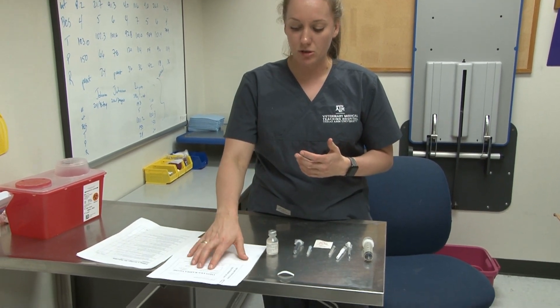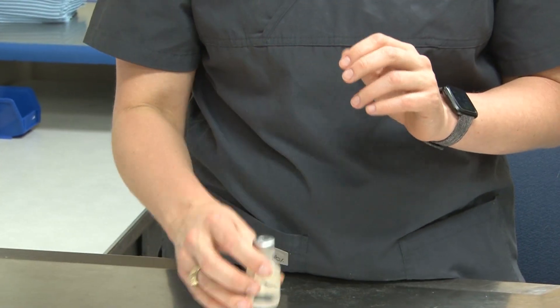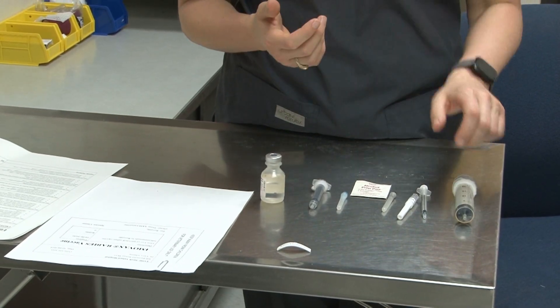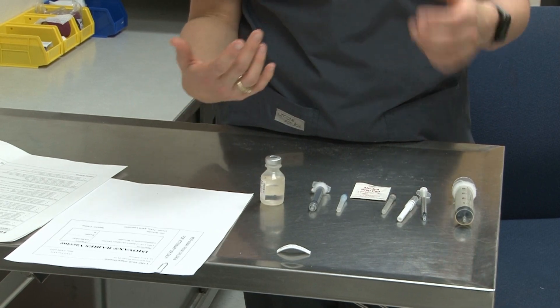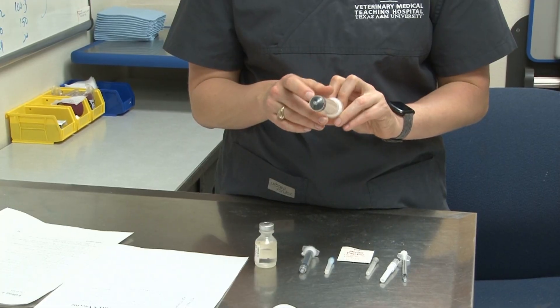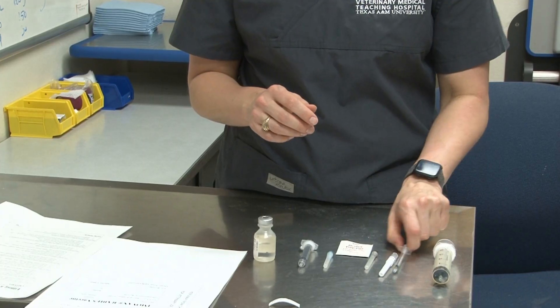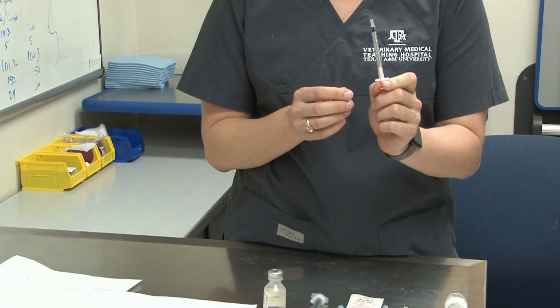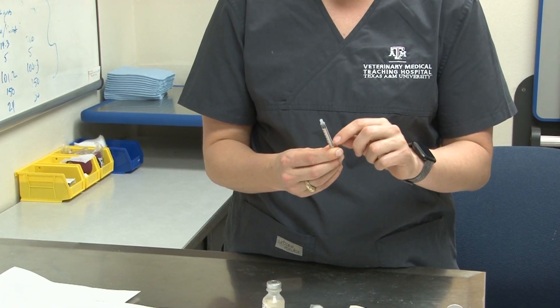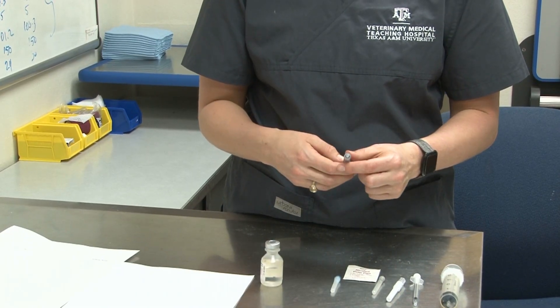To start, you want to look at the drug that you have, check that you have the correct drug, and then the amount will help us pick our syringe size. We only need one cc or one mil. A larger syringe would be too much — it's hard to get an accurate measurement with that much extra room. And a smaller one would have to be filled completely, which could get challenging. So we're going to choose this 3 mil or 3cc syringe.